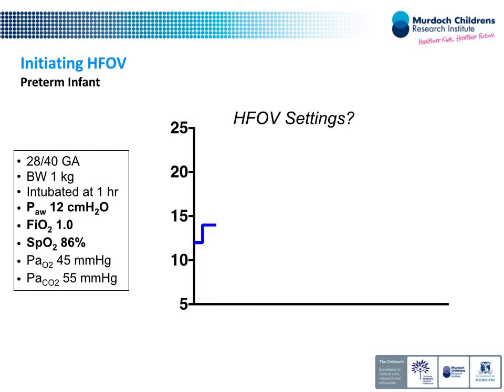Excellent. So that's the key thing, I think, is that when you pick a number, you might be wrong. To a certain extent, it doesn't matter what number you pick, although I probably wouldn't pick 25 and I probably wouldn't pick 3. And Anton can explain why they do something slightly differently. But it's not the number, it's what you do once you've made that decision that's the key thing. It's how you learn from the baby. So I agree, the initial number is just the initial.